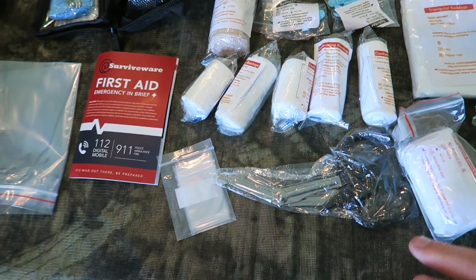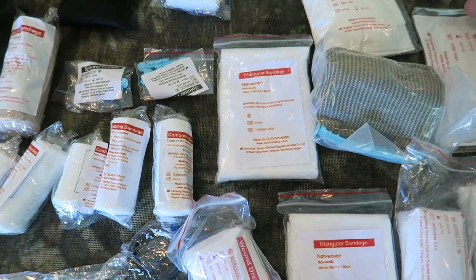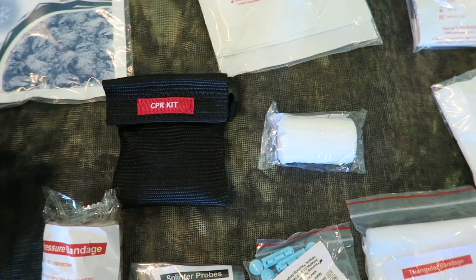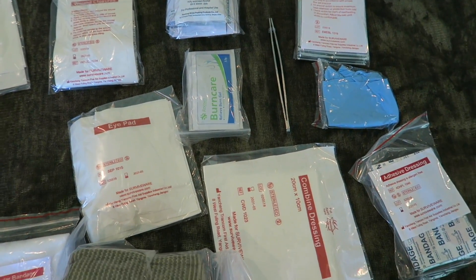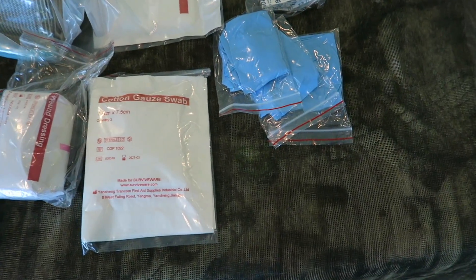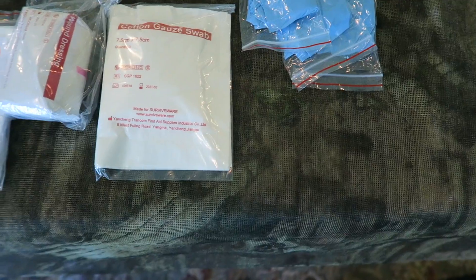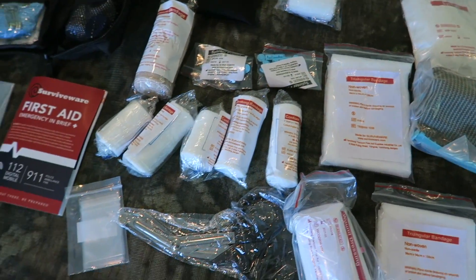Things for splinters, bandages, scissors, more tweezers, CPR kit, dressings, wound closures, alcohol pads. There is just so much — I don't think they forgot anything. I really don't. There's a lot of stuff that could help you in here and help someone else.